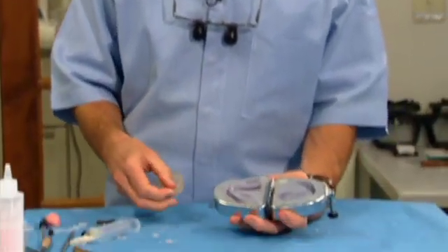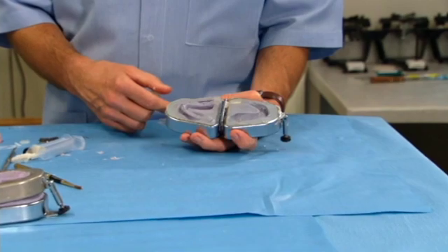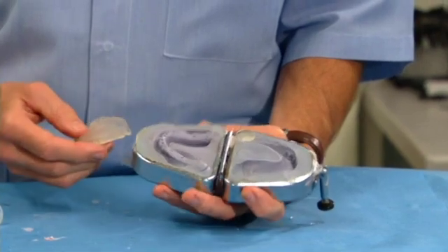Ms. Patel, we had made an immediate denture. When she first came to me, she had 32 teeth. And we had to extract every tooth in her mouth. She had 0 bone around her teeth. In fact, we extracted one of them when we made the initial impressions. It's always a fun day.